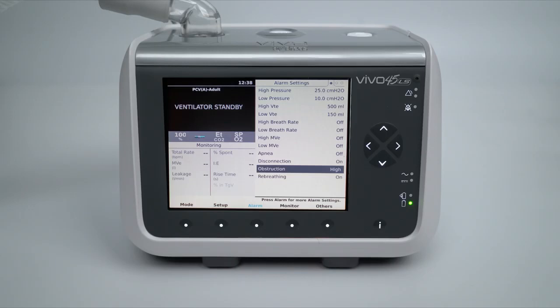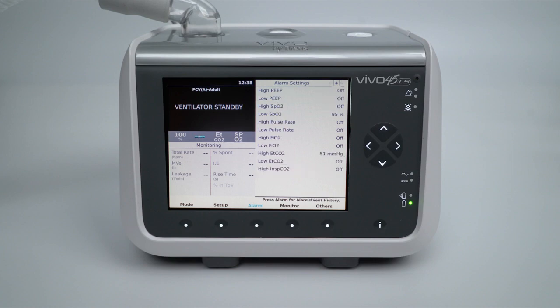The user can move to the second tab of the alarm settings by pressing the alarm menu key. These alarms are related to the advanced diagnostic measurements that the Vivo 45 LS offers. High and low values can be set for FiO2, SpO2, Pulse Rate, and ETCO2.